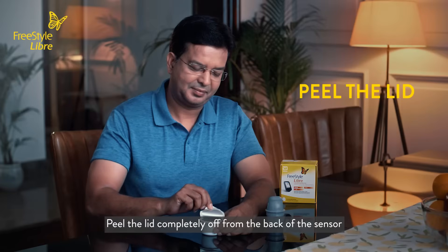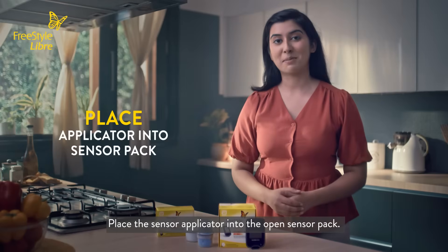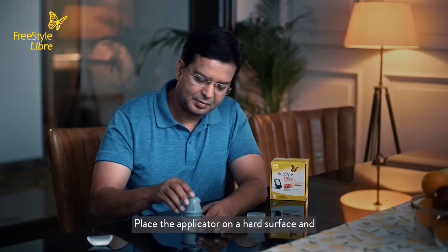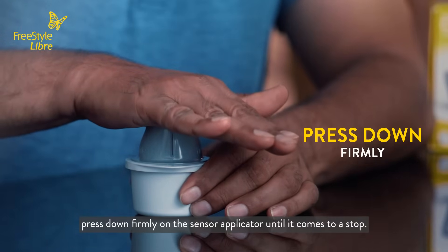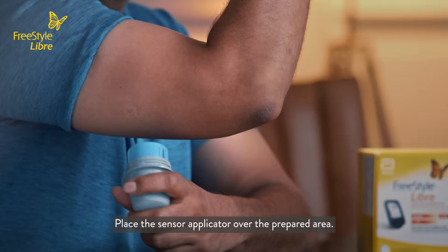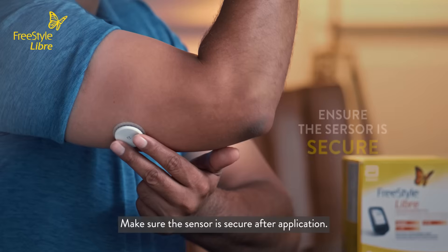Peel the lid completely off from the back of the sensor and unscrew the cap from the sensor applicator. Place the sensor applicator into the open sensor pack. Align the dark mark on the applicator with the mark on the back. Place the applicator on a hard surface and press down firmly on the sensor applicator until it comes to a stop. Lift the sensor applicator out of the sensor pack. Place the sensor applicator over the prepared area and push down firmly until the sensor is in place. Make sure the sensor is secure after application.